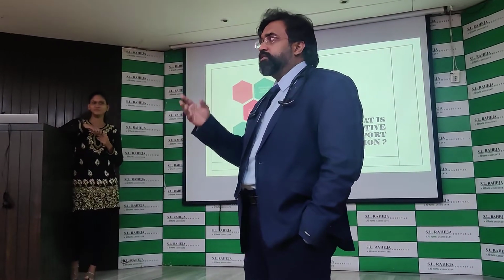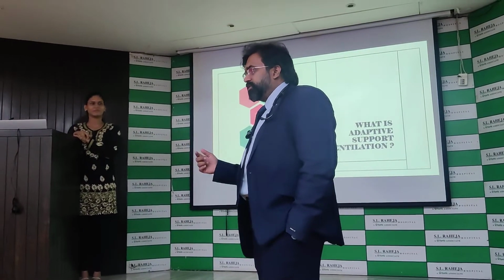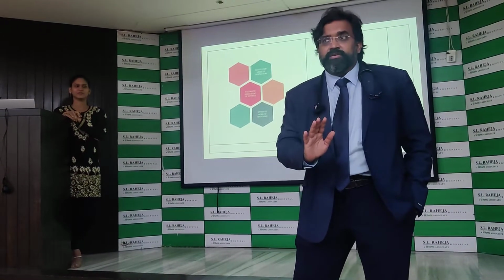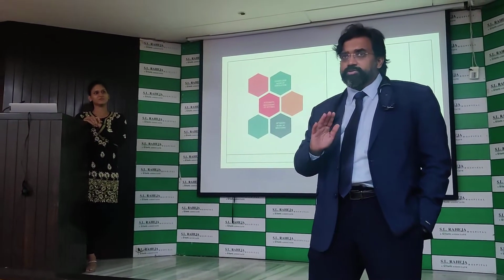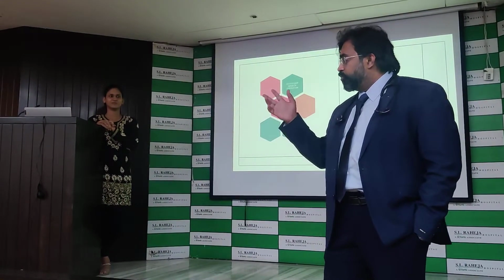You see, the pressure volume is giving 300, 300. If you have a bronchospasm, what happens? Nothing. 300, 300, 300. Closed loop is a kind of knowledge-based system, where the ventilator looks at what you're doing inside and then gives you feedback: okay, boss, your plateau pressures are going up, or your volumes are too high, and it gets back to you. That's a closed loop. Closed loop and open loop.